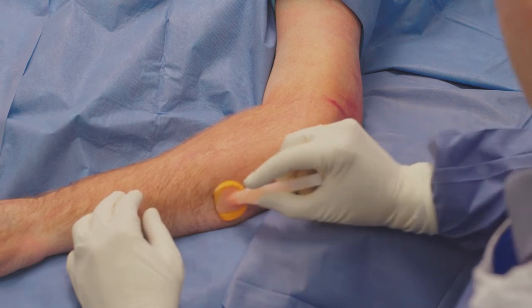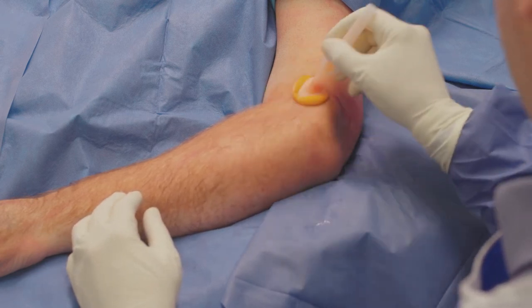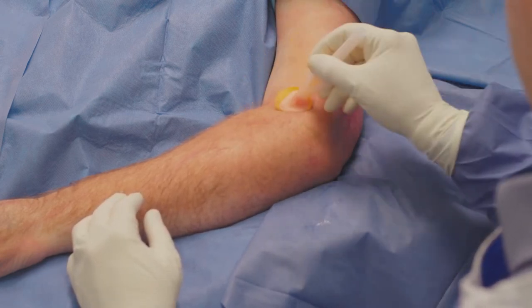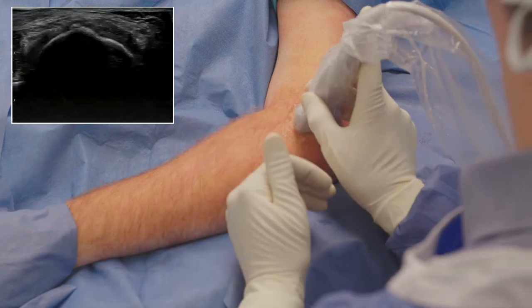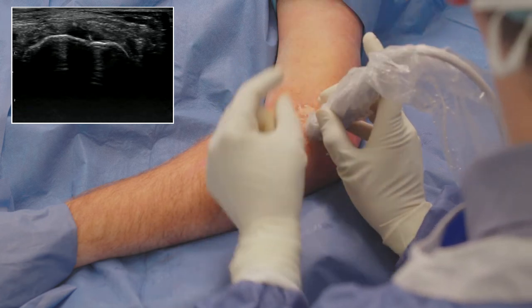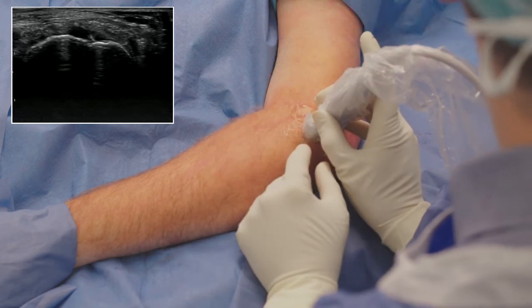Prior to the procedure, the patient is draped and prepped to disinfect the surgical site and create a surgical field. The procedure is performed under ultrasound guidance to visualize both the pathologic tissue as well as the positioning of the TenJet device.